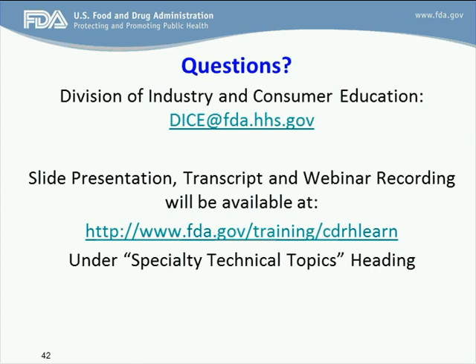Yes. So we test every method, but we're not required to test every combination. In other words, cleaner 1 with sterilization method 3, and then cleaner 1 with sterilization method 2. You treat them as independent. To validate the cleaning method and the sterilization methods, they have to be validated separately and independently. If you're looking at biocompatibility or compatibility of the device with the processes, that's different. And then again, whatever you're recommending in the labeling, that is what you need to test and validate.